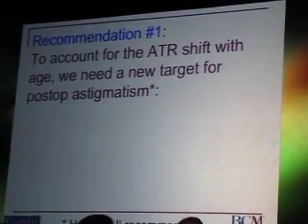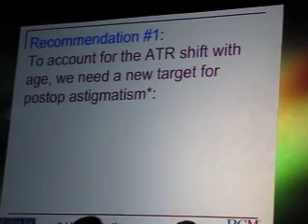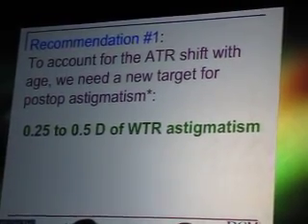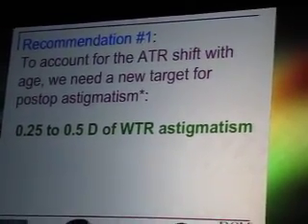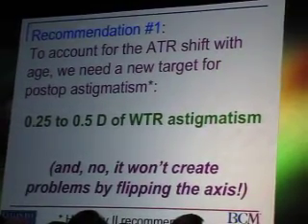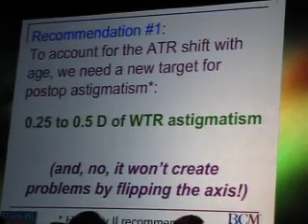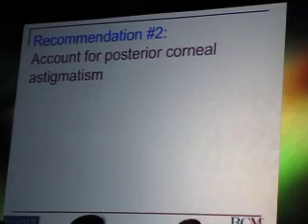Recommendation number 1 is to account for the against the rule shift with age. We need a new target for postoperative astigmatism, and that target should be slightly with the rule. And I know everybody's going to say, oh, you can't shift the against the rule to with the rule. They won't see. It won't affect them if they're not wearing glasses, and it won't affect them even with glasses as long as the overcorrection is less than a diopter. It just won't be an issue. And again, I would recommend using the Holladay II for these.